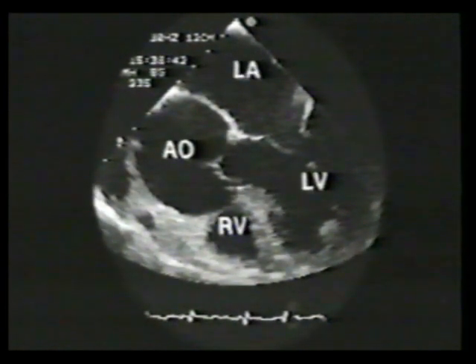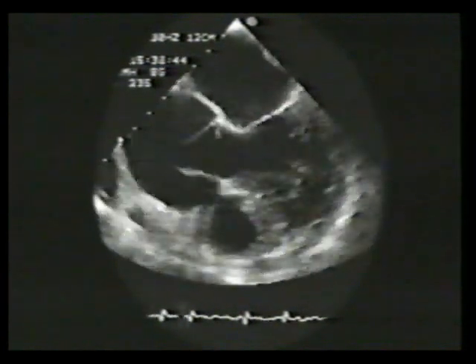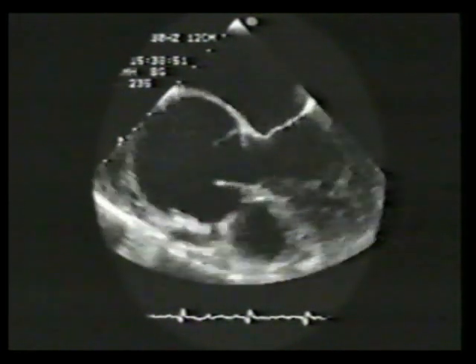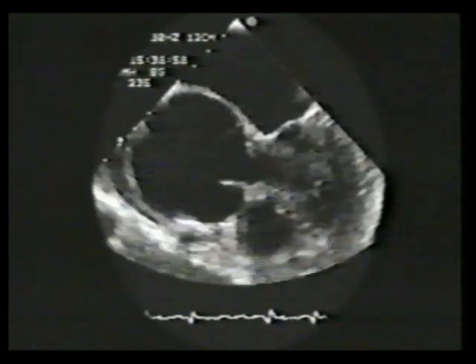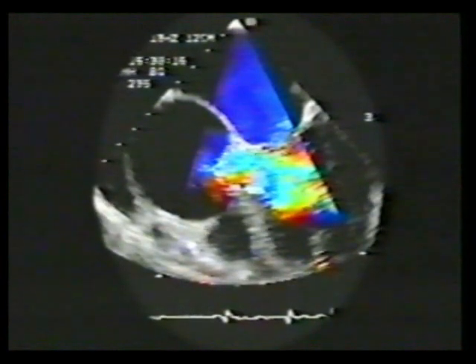Transesophageal echocardiography has rapidly become the method of choice for delineating diseases of the thoracic aorta, particularly in cases with suboptimal images from surface echo. The transducer is in the esophagus, behind the left atrium. The aortic sinuses are markedly enlarged. In this case, dilatation of the annulus has resulted in severe aortic regurgitation.